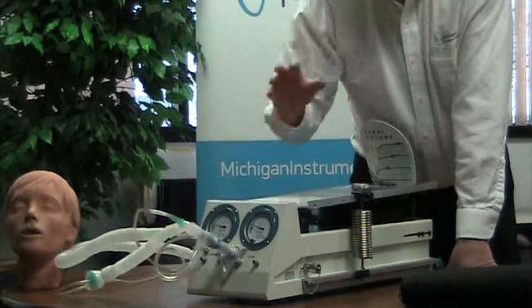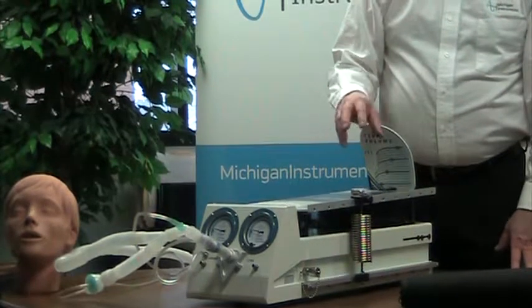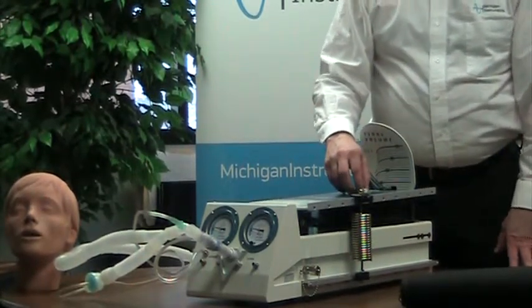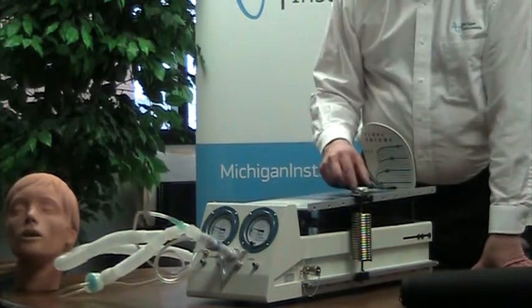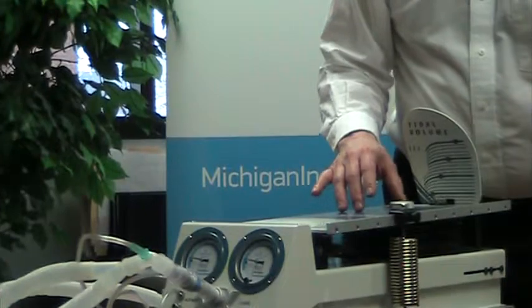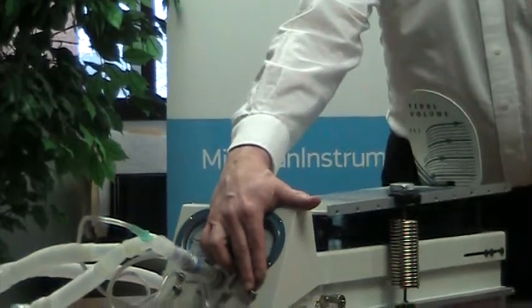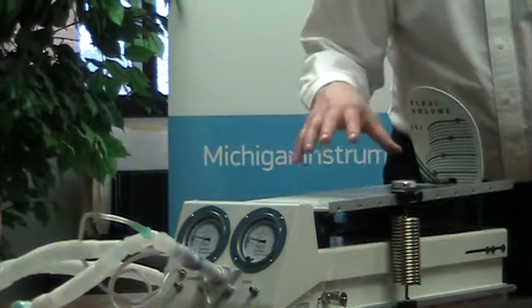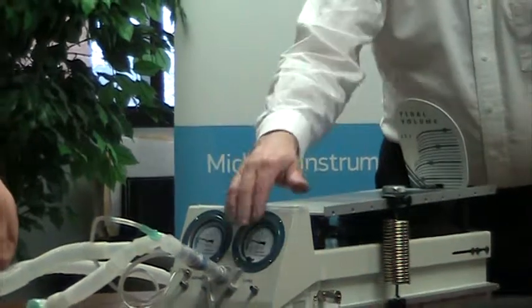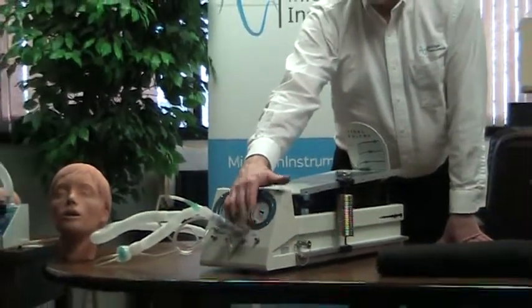They also incorporate some connections and openings that allow you to access the lung for different reasons. There's a port on the top of the top plate that can accept an oxygen sensor so you can measure the oxygen concentration in the lung. There's also a port on the front of the unit that you can use to introduce gas, measure pressures, or whatever function you might want to incorporate into your setup.